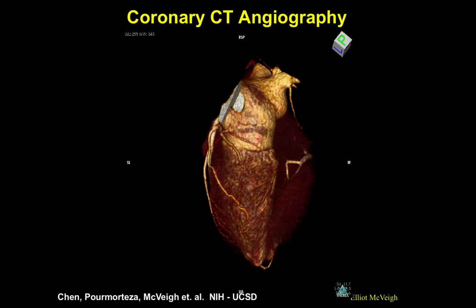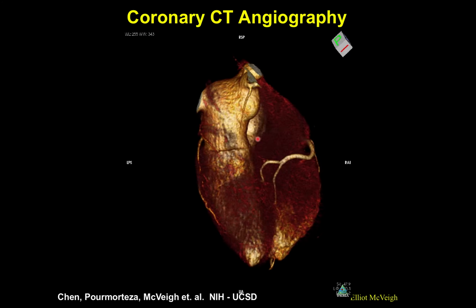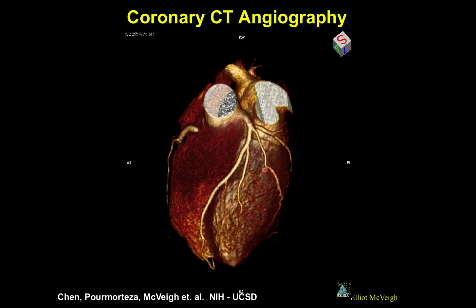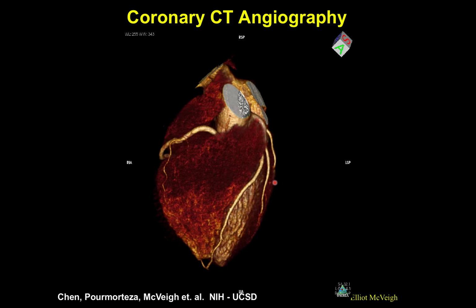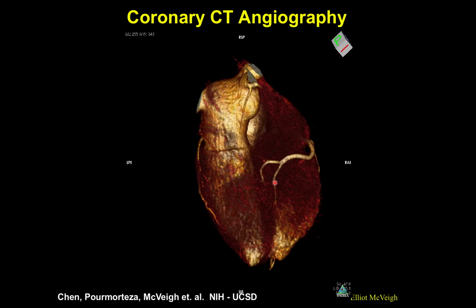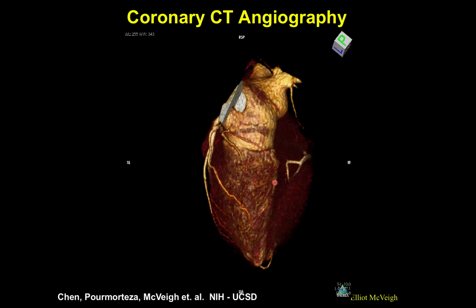Here's an example of rendering that volume data as essentially an object that's opaque, and you have a lighting model, and then the vessels show up as these opaque objects here. This type of data is not commonly used for diagnosis, but it is used to determine whether or not the images look reasonably good. When this data looks good, you know your images are probably artifact-free, and so clinicians then use the raw images themselves in stacks to make the diagnosis.